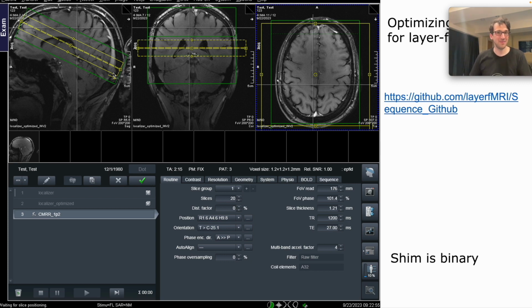On top of that, there are phase correction methods, even before GRAPPA, where, again, I say K-space, but actually I mean projection space, which is after you do the Fourier transform in the read direction, but have not yet done the Fourier transform in the phase direction. This is where GRAPPA and the Nyquist ghost correction are applied in the Siemens reconstruction. This means that you still have the entire image space collapsed. So the center of the projection K-space where the Nyquist ghost correction is happening is basically the collapsed signal of the entire slice. So you actually want to shim the front. That's basically what I want to say.